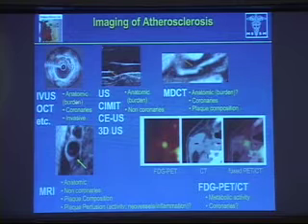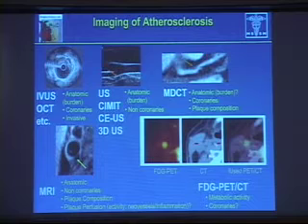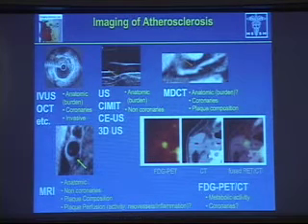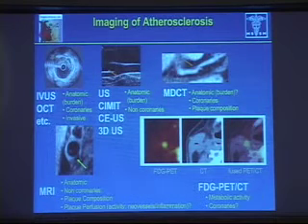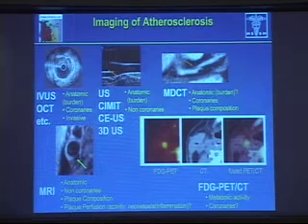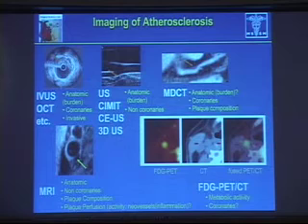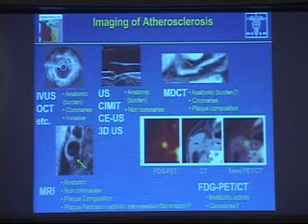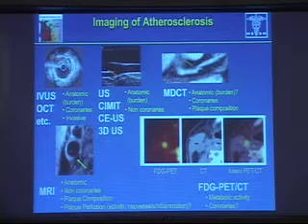I am not talking, like Jeffrey, about the invasive techniques; I think that's a whole different lecture. But the ones that are really emerging, and repeating a little bit from the previous speaker, multi-detector CT for plaque imaging is mainly today an anatomical feature, stenosis imaging. I'm not sure of the value yet in terms of plaque characterization, but I will talk to you about preclinical potential to take iodine and improve on the detection beyond iodine.